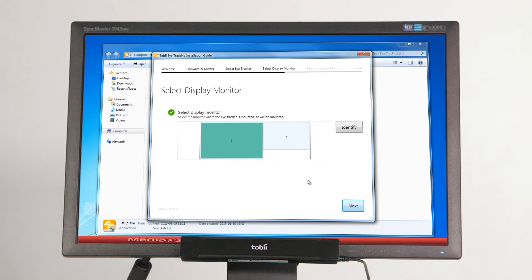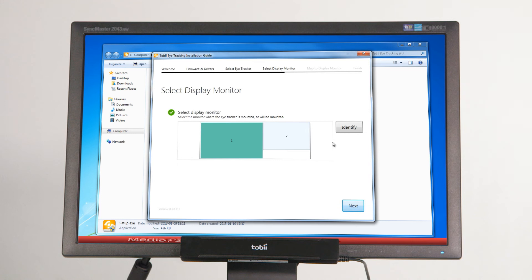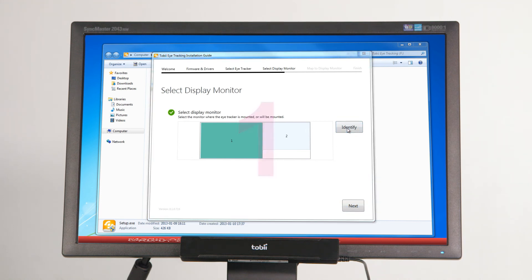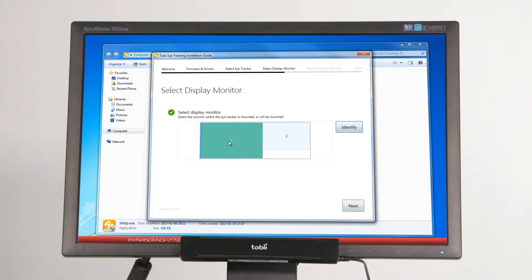The fourth step of the installation asks you to specify on which of the screens connected to your computer the eye tracker is mounted. If you are unsure which screen is number one or number two, click the identify button. When the correct screen has been identified, click on the screen illustration that represents that screen.